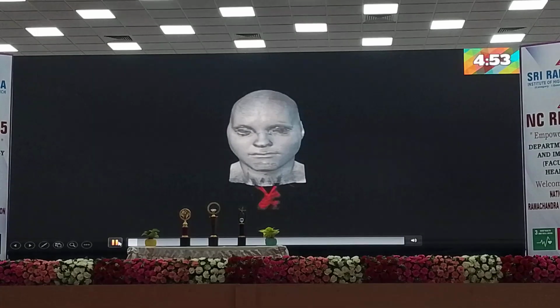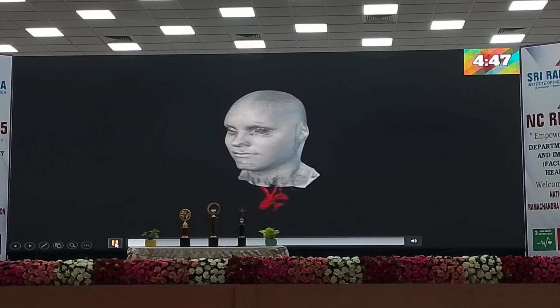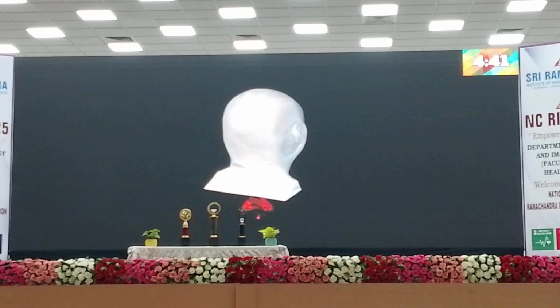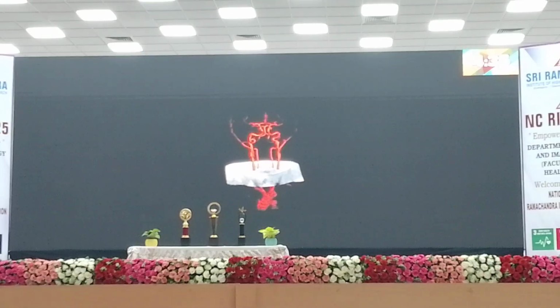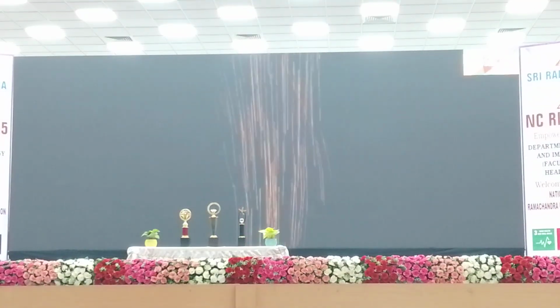Now you can see how ASL happens here. First we apply the RF pulse in the neck area. The RF pulse is inverted, and the blood, meaning the protons, goes inside and perfuses here. We acquire that image, which is the tag image. After that we acquire another image, which is the control image. We subtract them, and we get the CBF image.